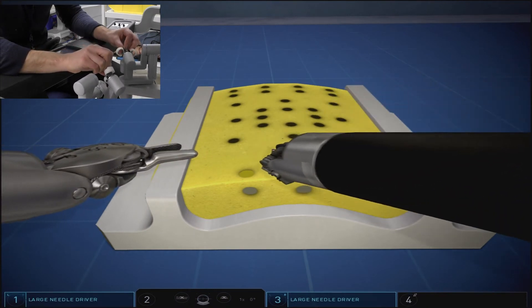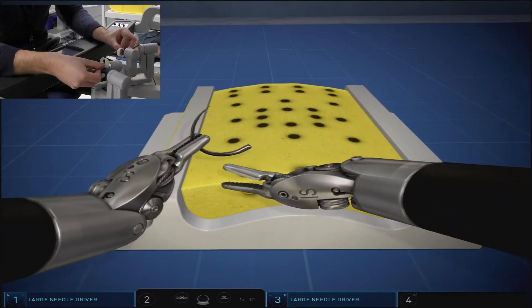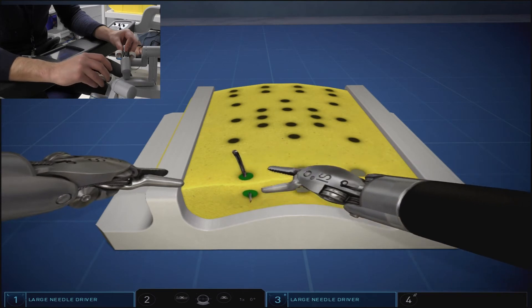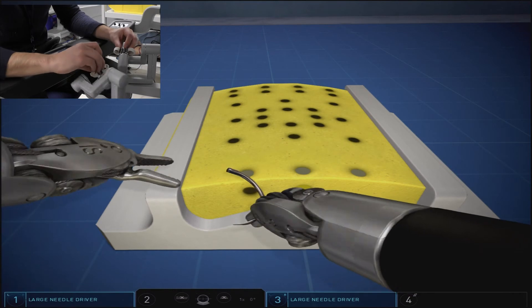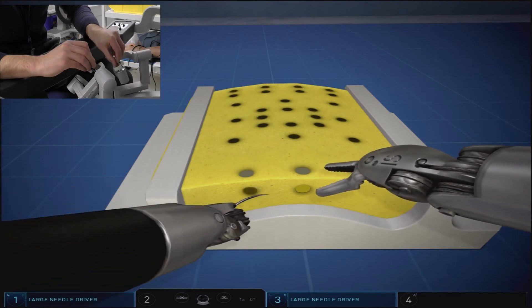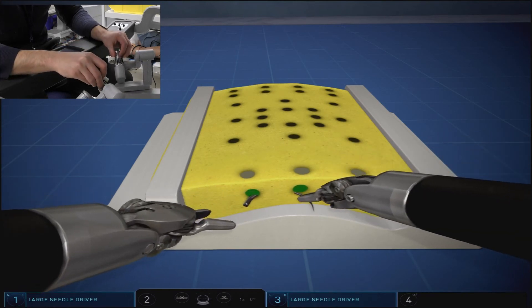As a general rule of thumb, we found that the best suturing technique is to use the right arm for any suturing taking place on the top part of the foam in the right-to-left direction. Any throw going through the corner in the vertical direction can be done with either arm. Suturing in the left-to-right direction, regardless of being on the top or the side of the foam, is best done with the left arm, just as suturing in the right-to-left direction is best done with the right arm.